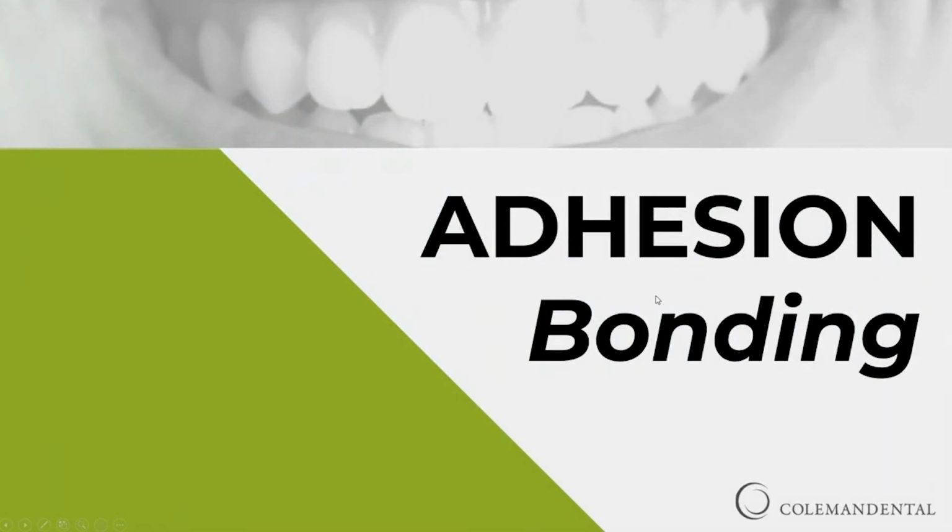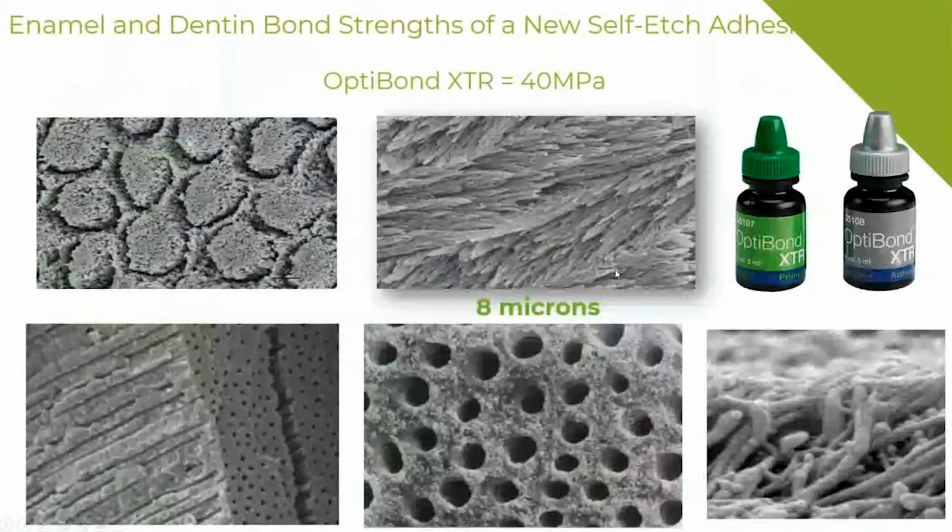Adhesion bonding, let's talk about that, because if you don't get this part of it right, it doesn't matter what you're using from that point on, you're going to have problems. And again, I wish I had another couple of hours just to talk to you about adhesion, because I think a lot of people, if they have mistakes or problems or pain or failures, it's going to be in their bonding really more than the composites themselves.